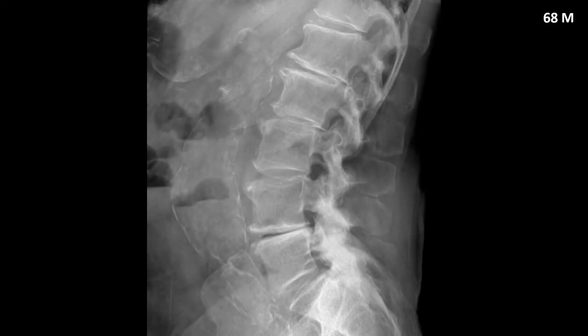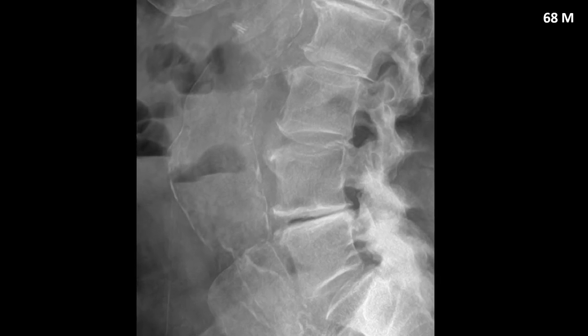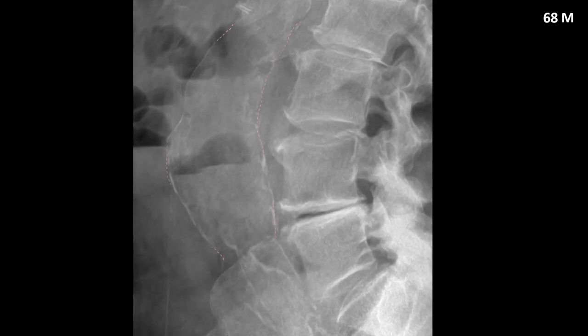This is a 68-year-old male who presented with low back pain. Abdominal aortic aneurysms are more commonly seen in men than females. As we zoom in, we can see a focal dilatation of the abdominal aorta anterior to L4, and this measured greater than 5 centimeters, which will need to be pushed on to advanced imaging such as ultrasonography or CT.